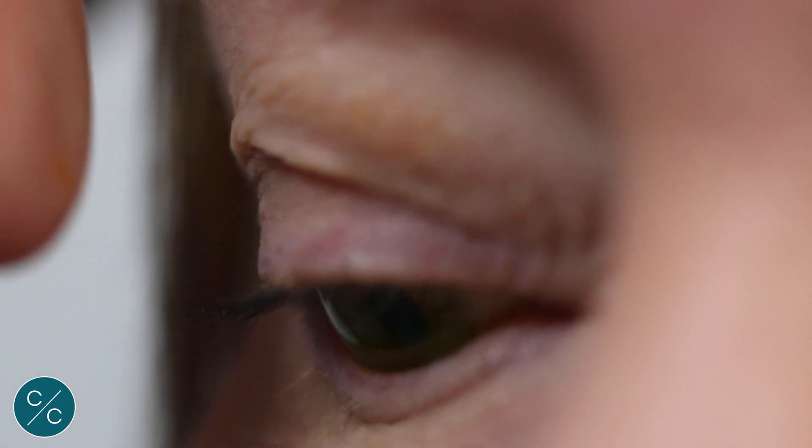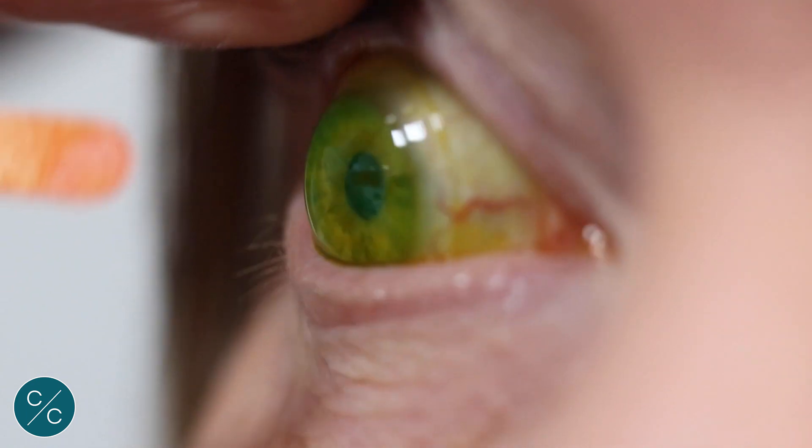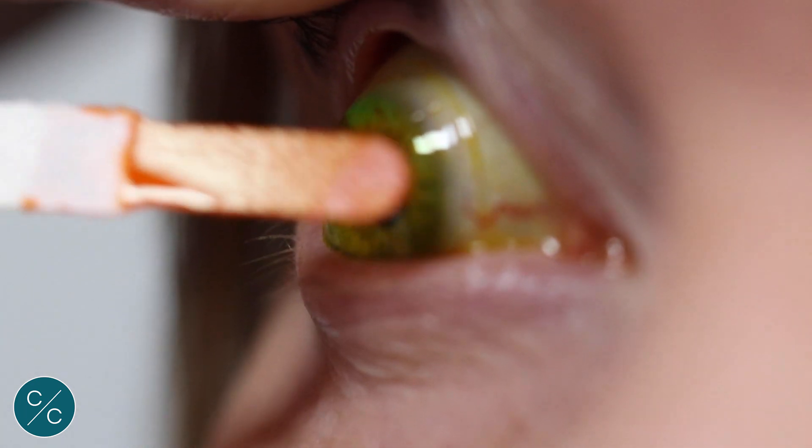Another tip is that if you have difficulty viewing the front of the lens, we can actually put some fluorescein — just a wet fluorescein strip on the front of the lens — and then we can have a look under the slit lamp and we can see a fluorescein lens sandwich, which will actually show the lens in clearer detail.